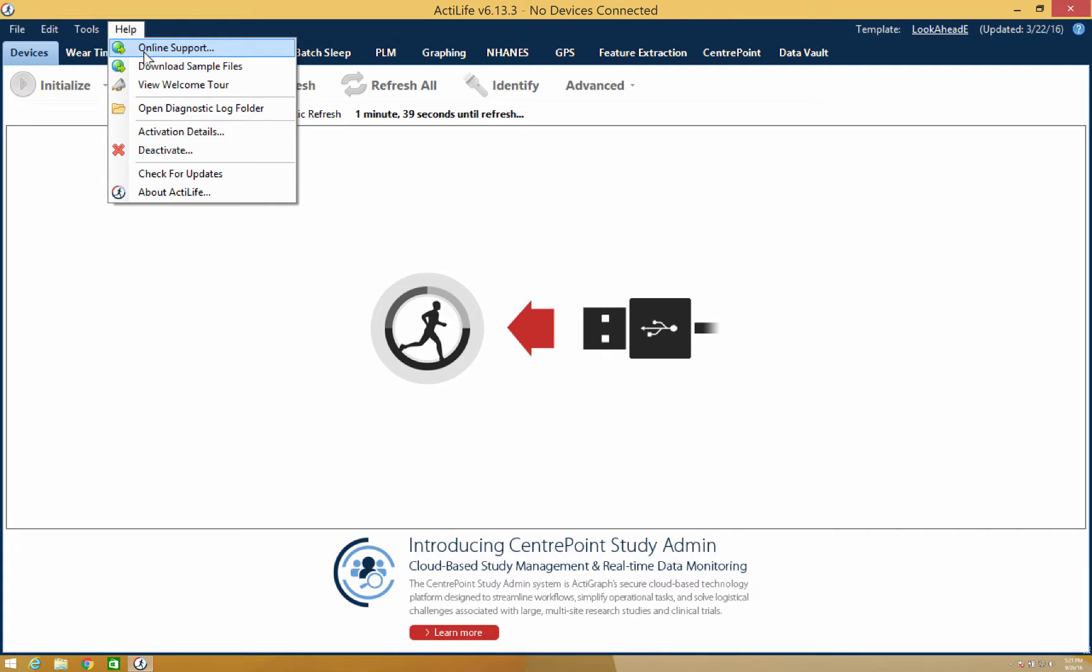Under the Help tab, you'll also be able to view your activation details, which will include important information such as the current number of users on your license, the maintenance end date, and the product's key number. You'll also be able to deactivate your software for when moving it to another computer.